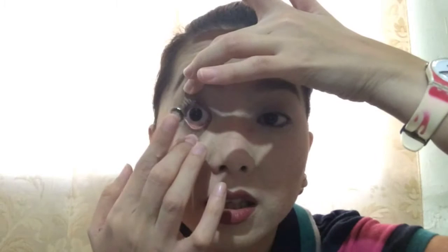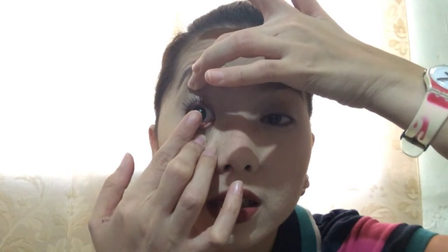This is for my right eye and this is for my left eye. I will start to put my right contact lens first. I use both middle fingers to open my eyes like this, and then I put in the contact lens.